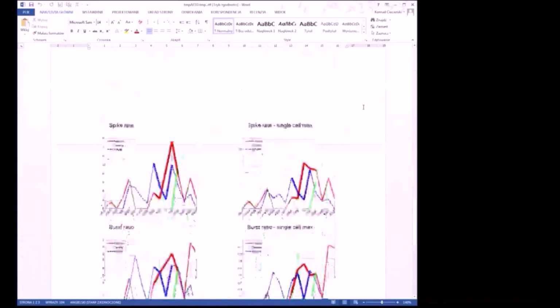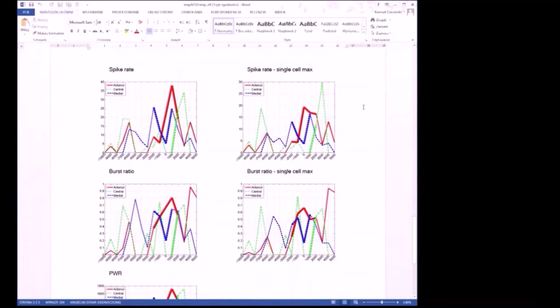This is because spike-based attributes rely solely on the detection of the spikes. In some cases, within the STN, where normally one would expect high spiking activity, the electrode happens to be in an area without any active cells near it. So, we can obtain a false negative result. We can think that we are outside of the STN when in fact we are inside of it. It is also possible to have it the other way around.